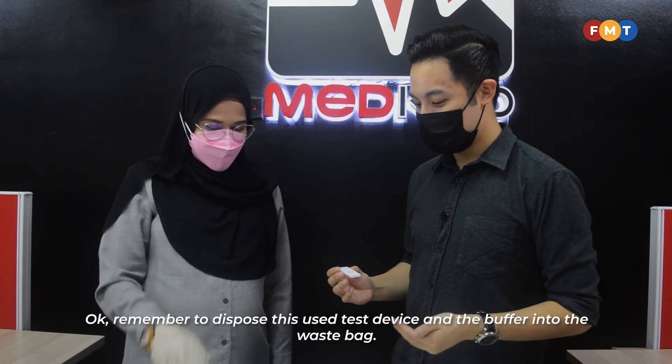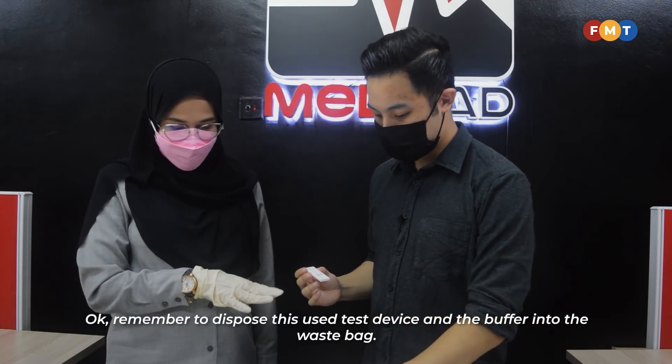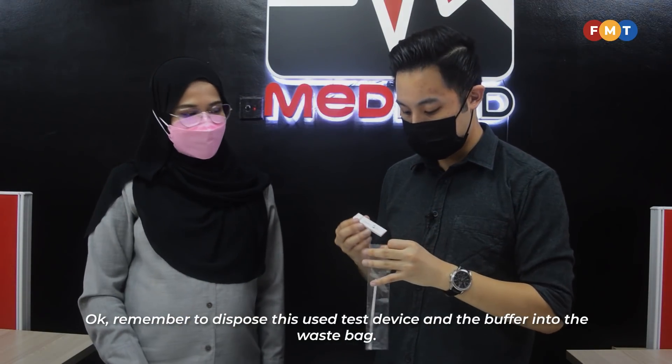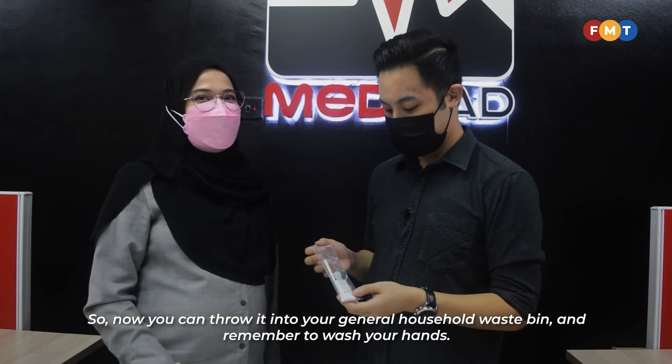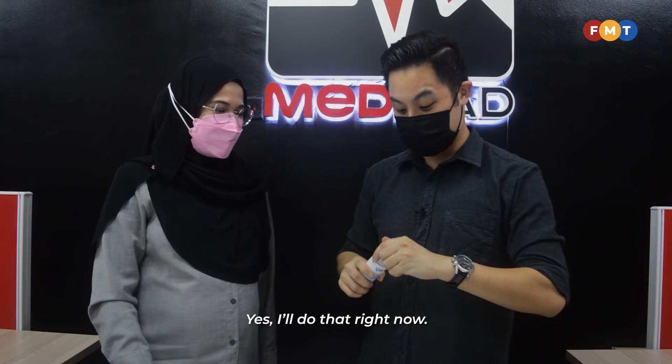So how do I dispose of it? Remember to dispose of the used test device and the buffer into the waste bag. Now you can throw it in your general household waste. And remember to wash your hands.